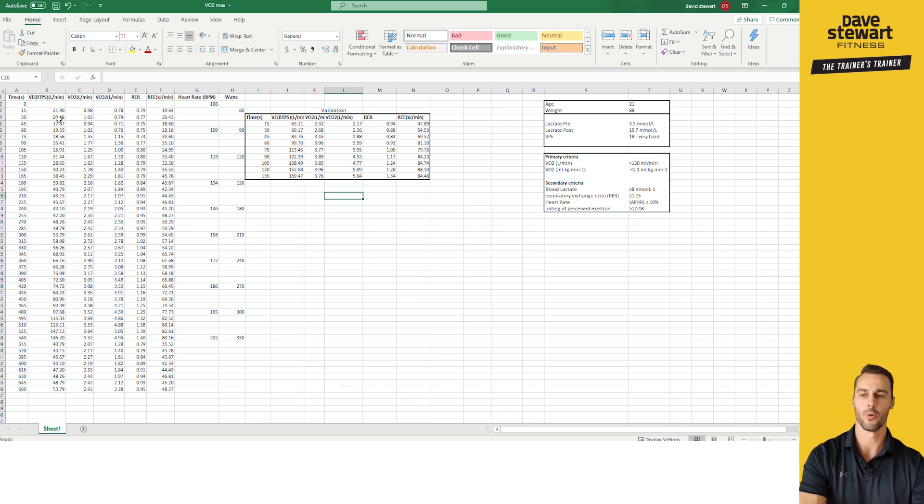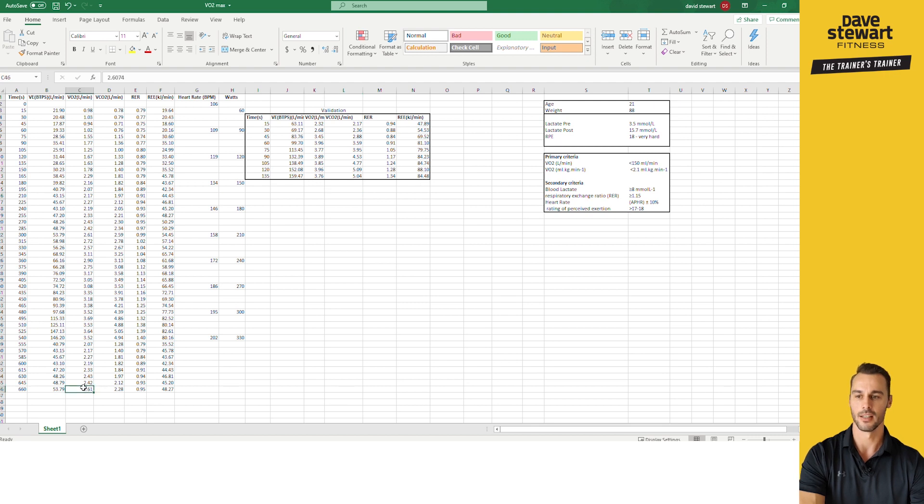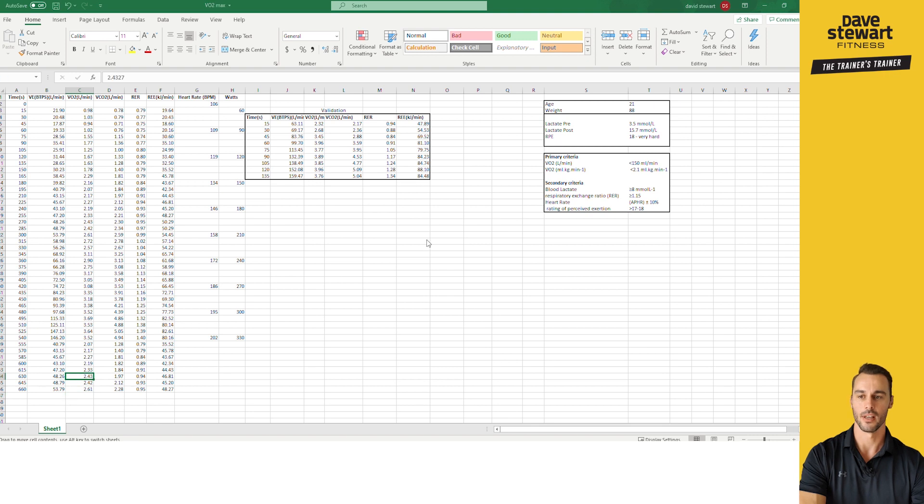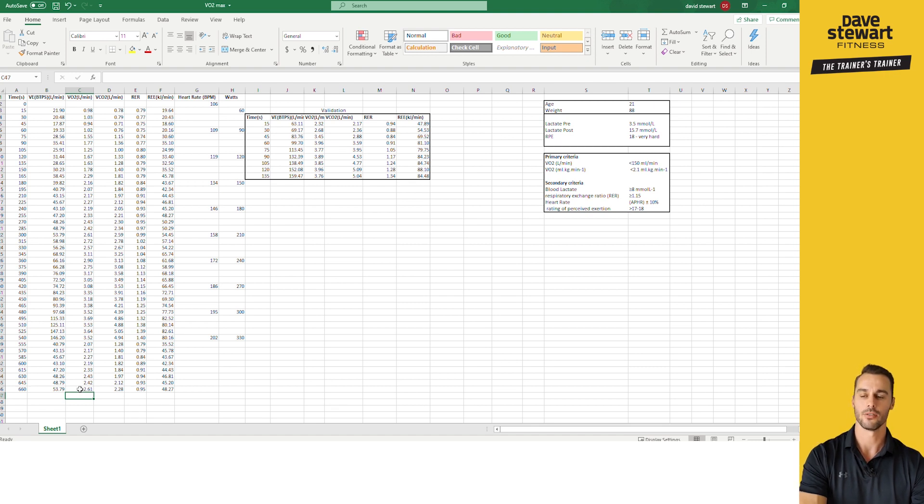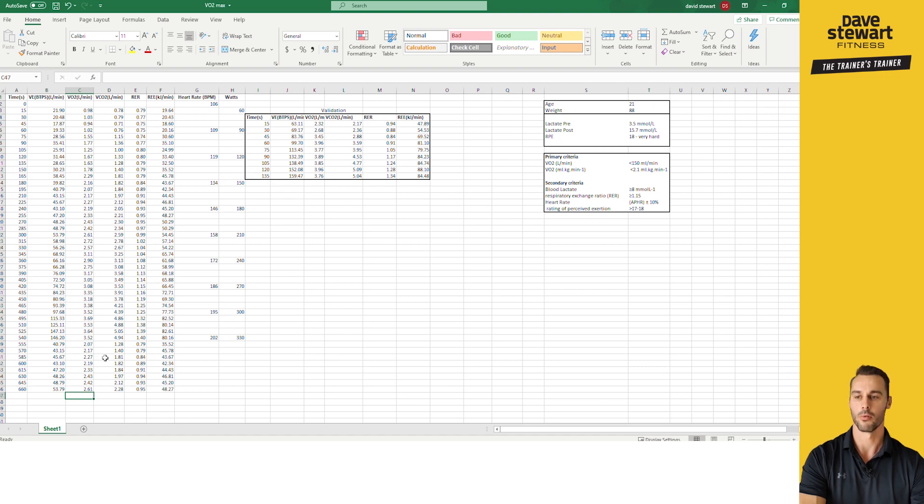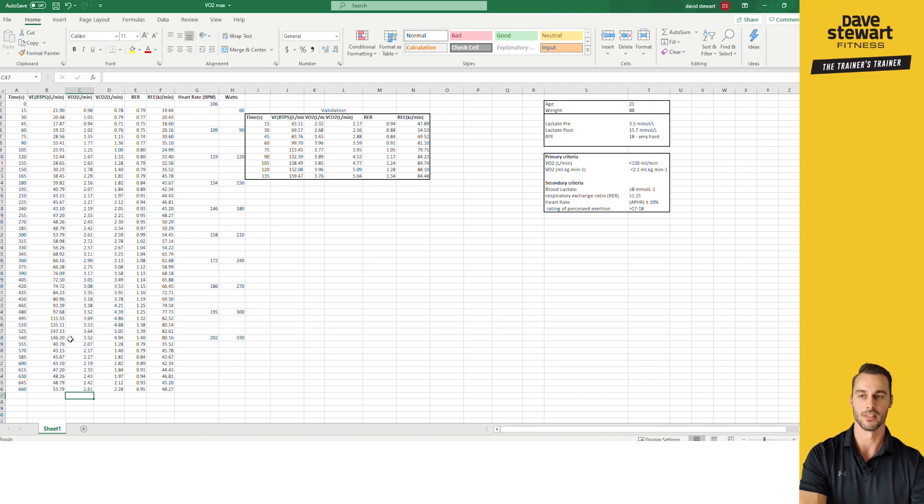So the first thing I want to point out, and this is something that you were warned to be wary of, is don't just take the last minute. So this is the ventilation, the last minute's data here. If I just average those out, I would actually have incorrect values because somebody forgot to turn the measuring device off at the end of the protocol. So the way you can tell that easily is look at the ventilation. Here we're doing 147 liters per minute, 146 liters per minute, and then 40 liters per minute.